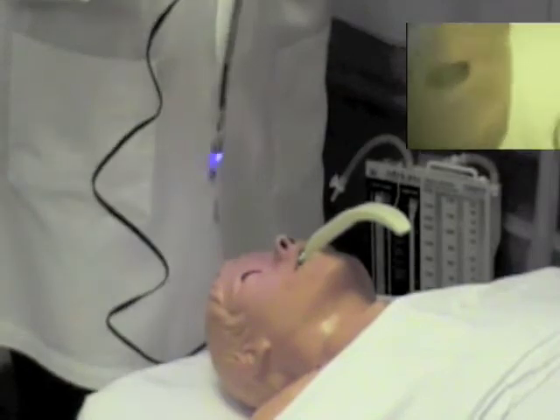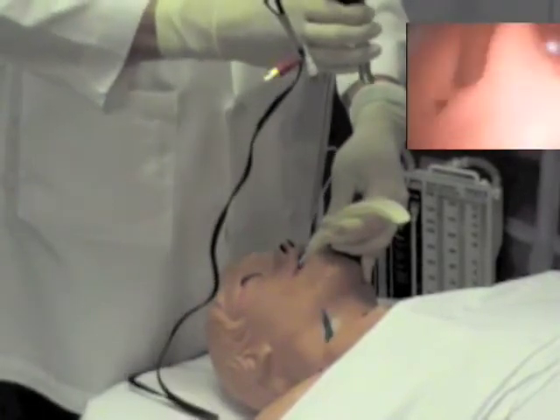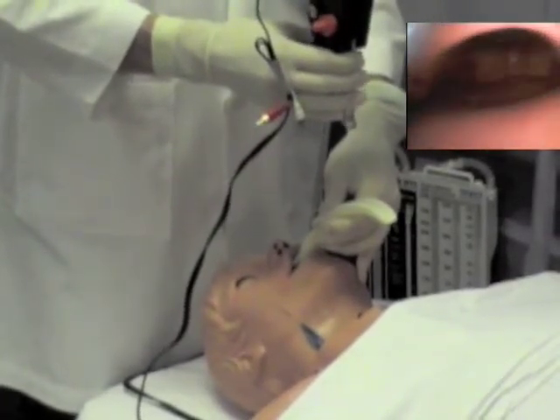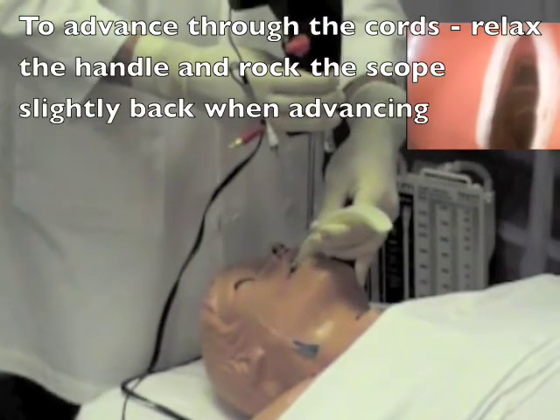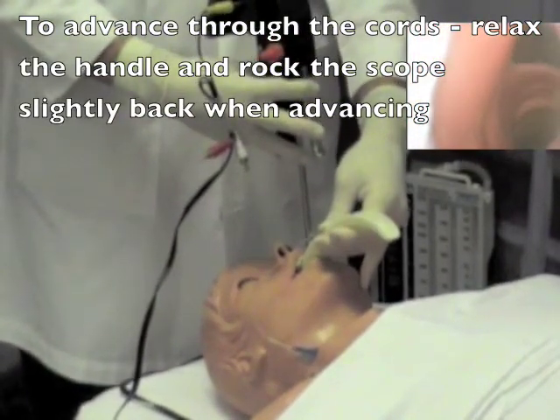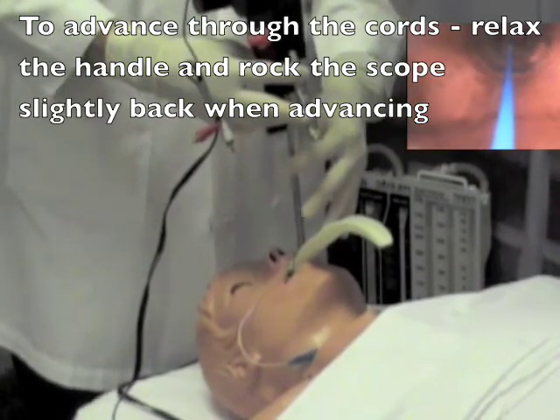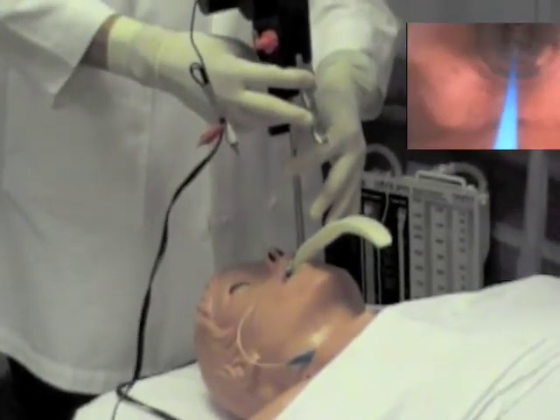Then take your video rifle and follow the channel generated by the rifle blade guide. As you can see, there is the epiglottis. Now I am going to gently relax the handle, slip under the epiglottis, and I visualize my vocal cords. Now I will gently rock the scope back through the vocal cords, relax the handle, and advance the tube. At this point, I can clearly see that I have passed through the vocal cords. You are able to see the arytenoids and cords.